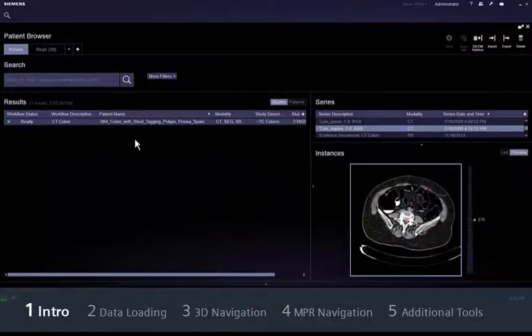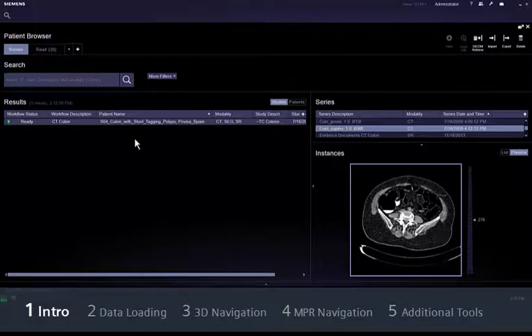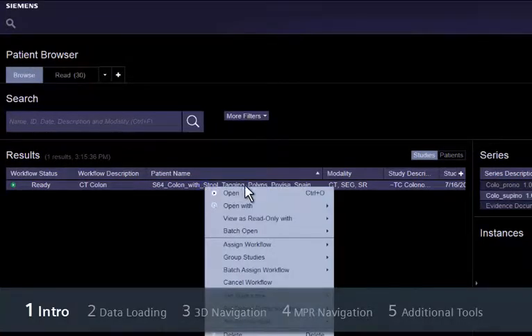First, make sure that the study is correctly assigned to the CT colon workflow. If it isn't, right-click the study and select Open with CT Colon.